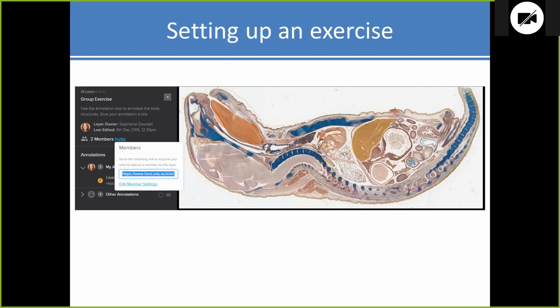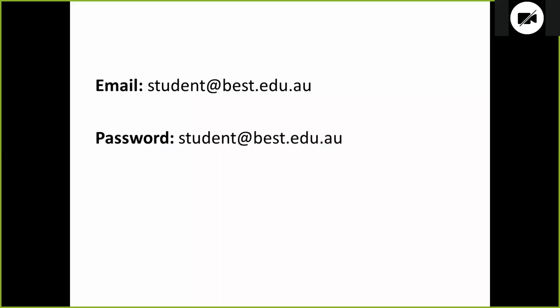So when you follow these links, you'll be asked to log into Slice. I know some of you probably already have your own accounts, and feel free to log in with those, but if you're having trouble logging in, I've shared this account with you that will allow you to participate. I've also shared these details in the chat so you can copy and paste. The username is the same as the password.